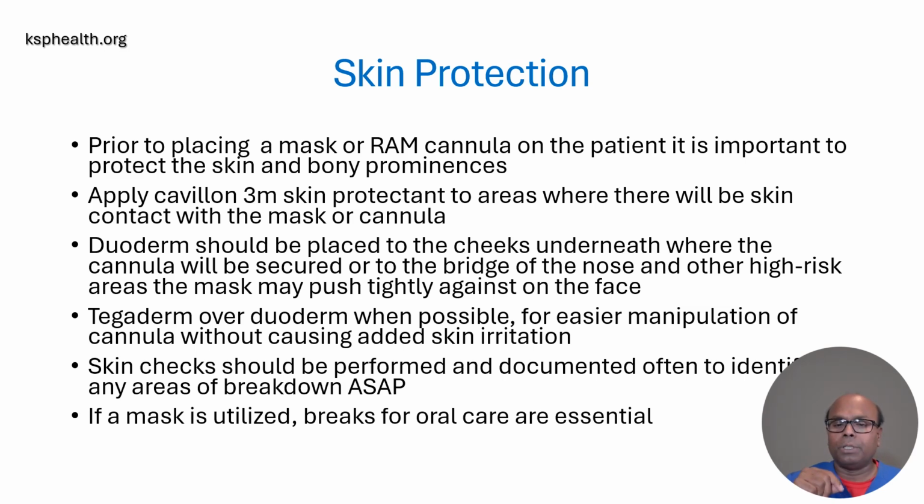Duoderm should be placed on the cheeks underneath where the cannula will be secured, or on the bridge of the nose and other high-risk areas where the mask may push tightly against the face. Tegaderm over Duoderm when possible for easier manipulation of the cannula without causing added skin irritation.